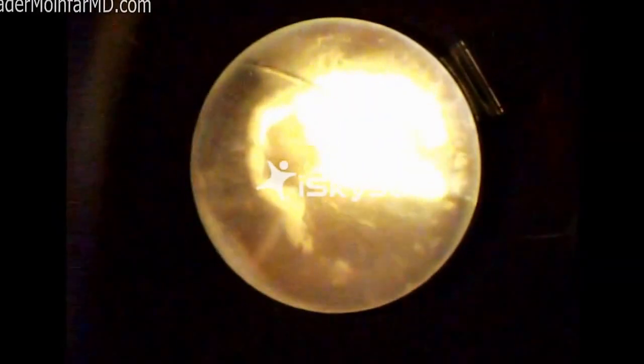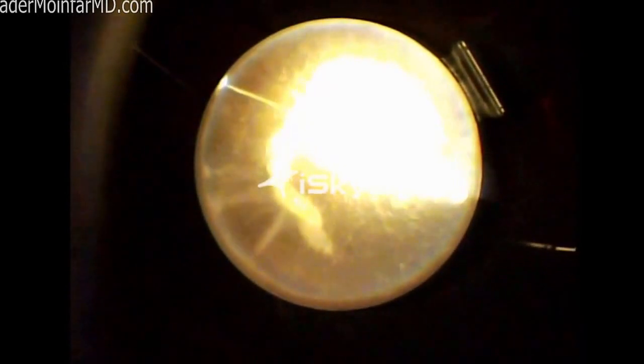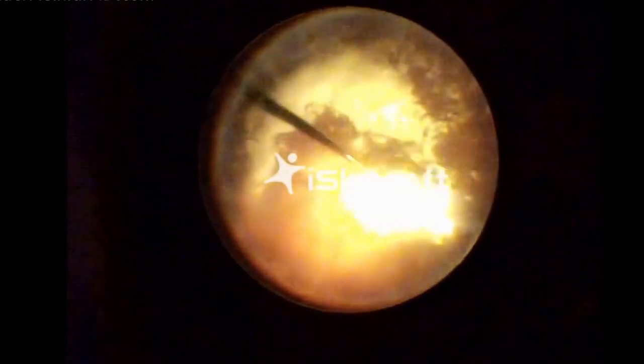Fortunately, where I operate, we have very experienced scrub nurses that can assist us with indenting the eye during surgery and help us see the hidden areas that would otherwise be very difficult to access. Now at this point, I think I have most of the posterior vitreous already detached, and I'm just working on removing the rest of the vitreous gel. At this point the case is about one third completed, and we're just making sure to remove as much vitreous as possible.